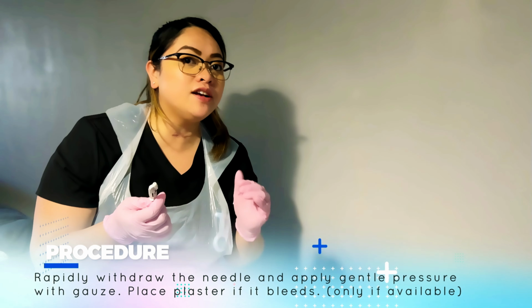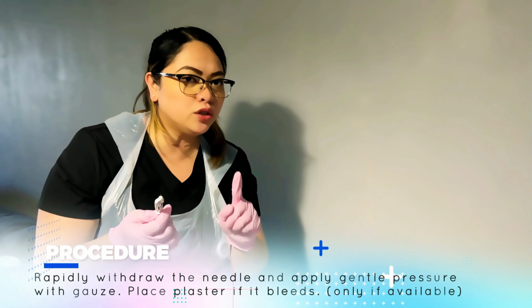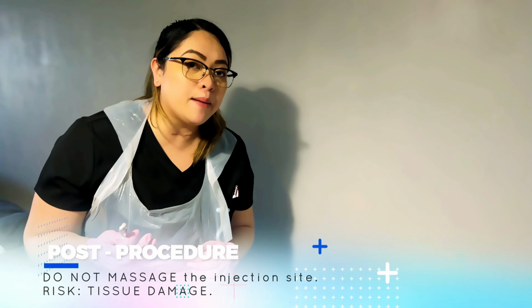If you find any gauze in the station where you are doing your exam, then get it, okay? Make sure not to forget to check the expiry date. If not, then you don't have to worry. Just advise the patient to apply gentle pressure, but make sure not to massage the area to avoid the risk of tissue damage, okay?